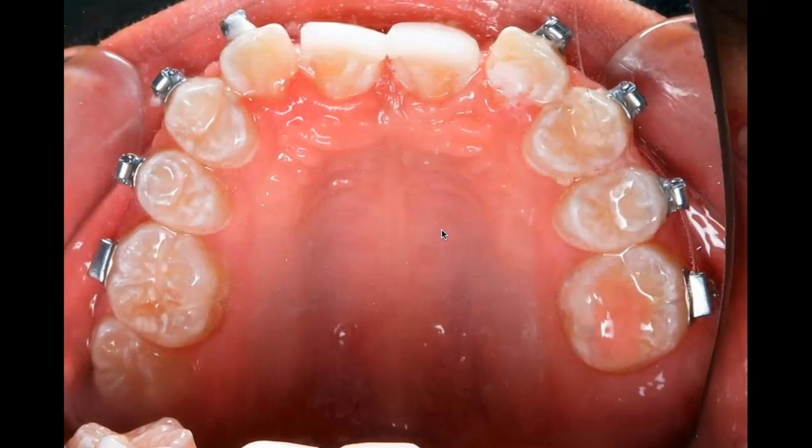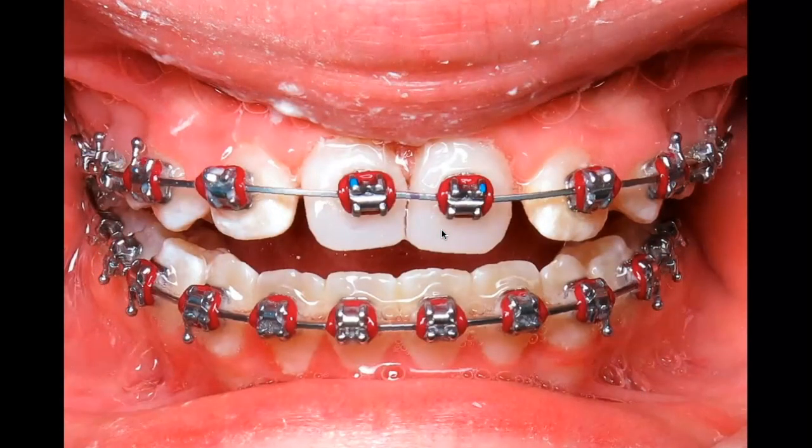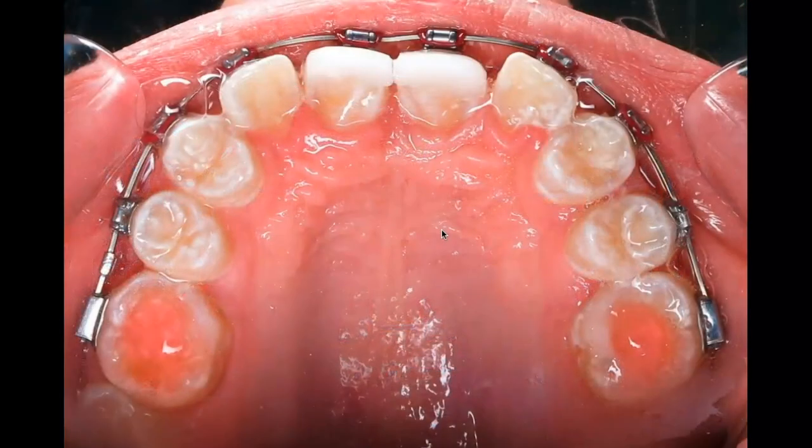And you can see that there was still a rotation as well. We want to build all of that into the restoration so that when you straighten those teeth, the roots are straight as well and hopefully not derotated. And she goes back to school and she's still got front teeth, or at least something that looks sort of like normal front teeth. Okay? Teeth move out.